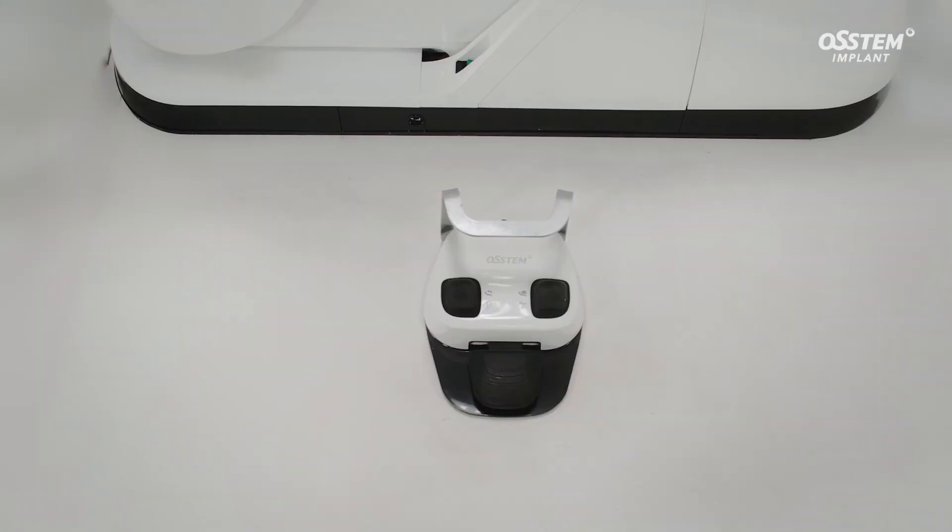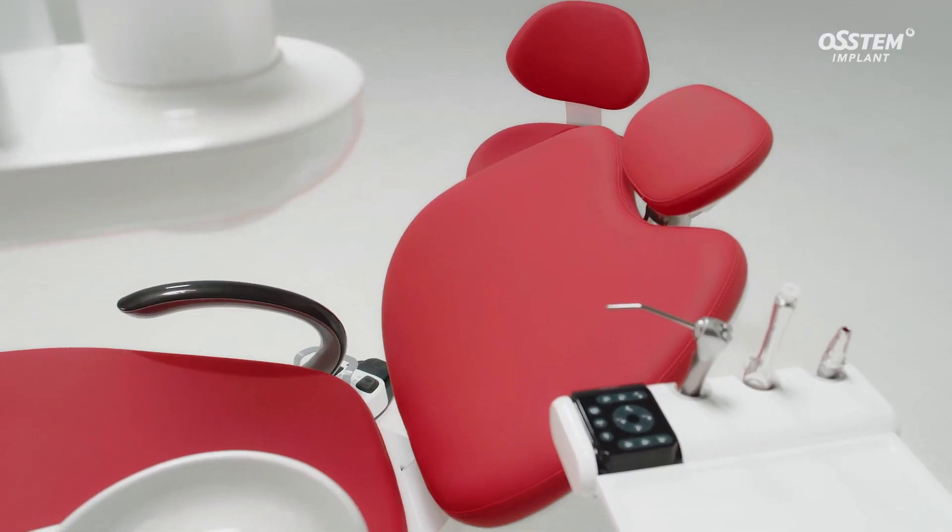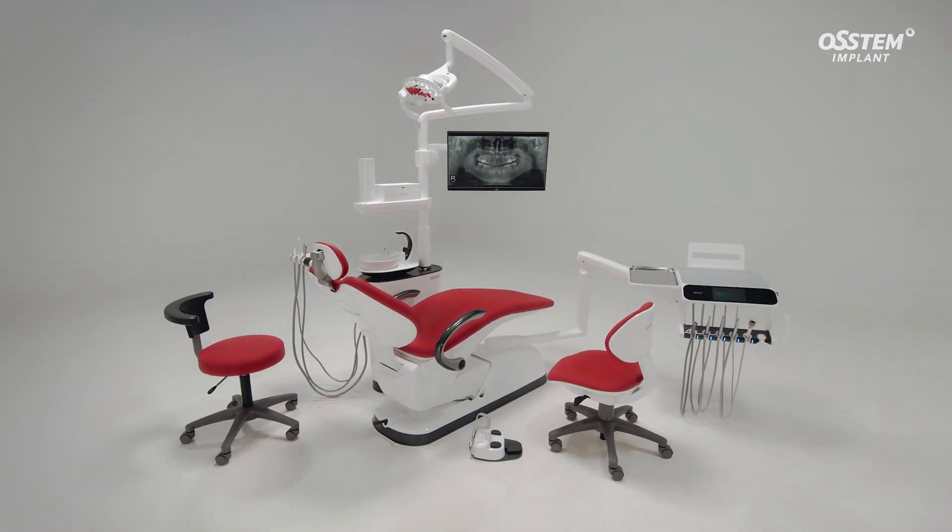Try the K5, a unit chair designed to add both convenience for the dentist and comfort for the patient.